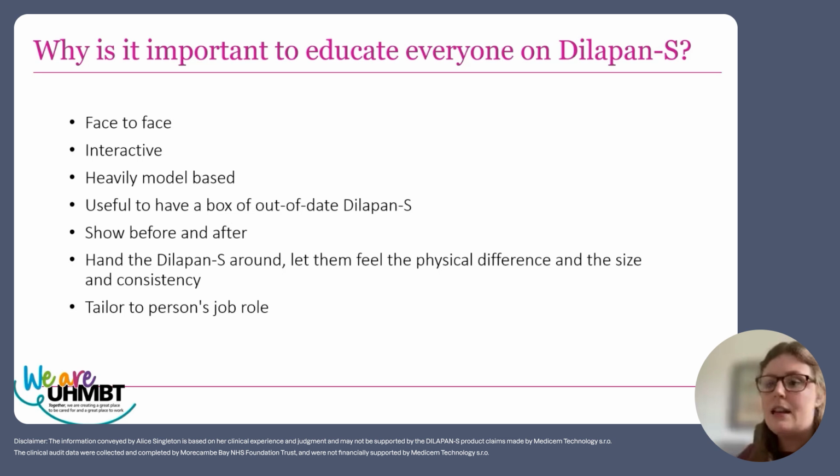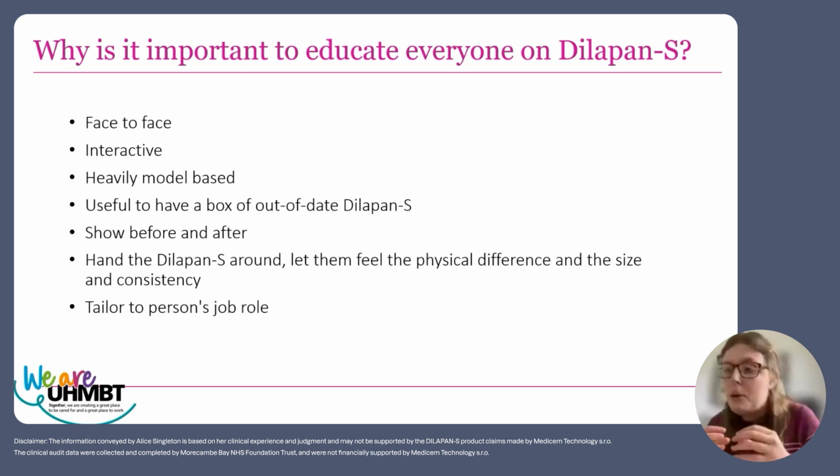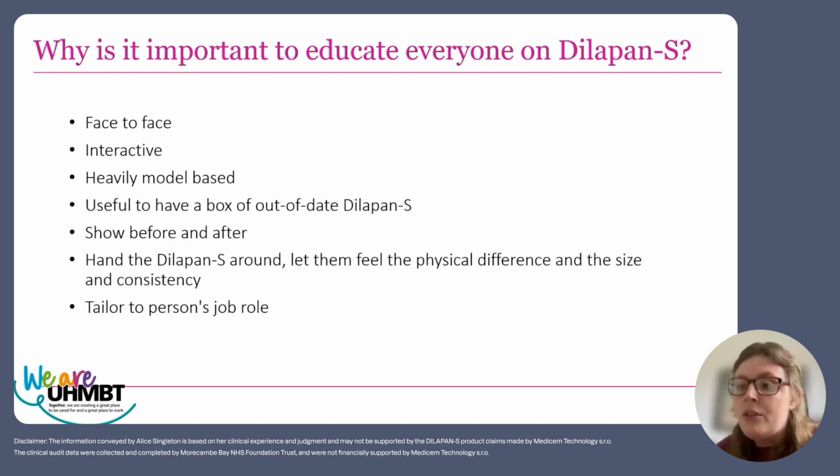Being really interactive, being really heavily model based. So I generally do my teaching in small groups or one-to-one. I take my box with me, which has Dilapan written on the side of it, because I'm well snazzy like that, in a Sharpie. And I carry it, and it has all my models in it, all my bits and bobs, and I always carry a box of out-of-date Dilapan sticks.